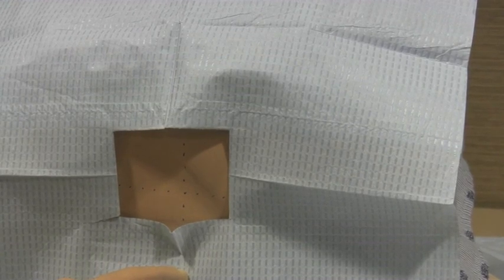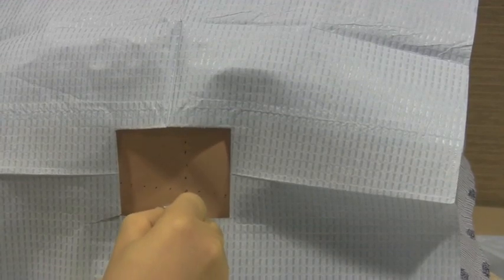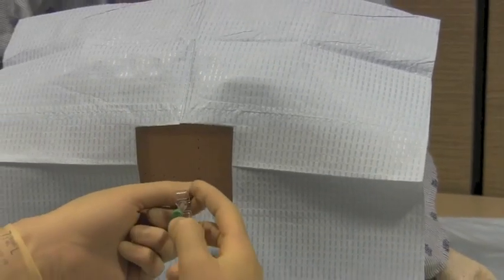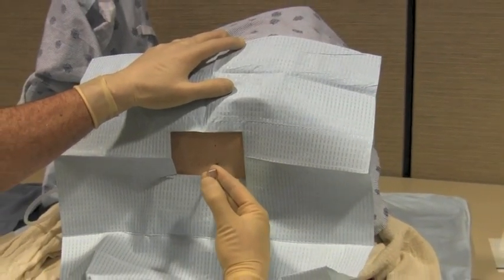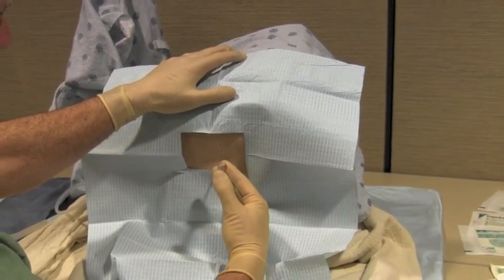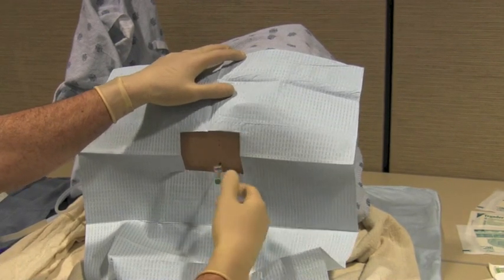At the L4-5 or L5-S1 interspace, the needle will be inserted. It is gently advanced between the spinous processes until we're in the thecal sac.